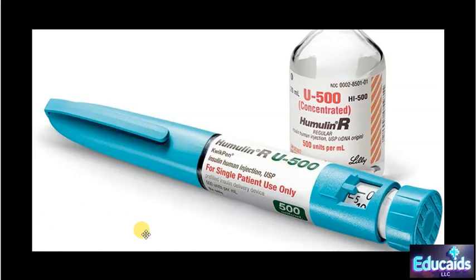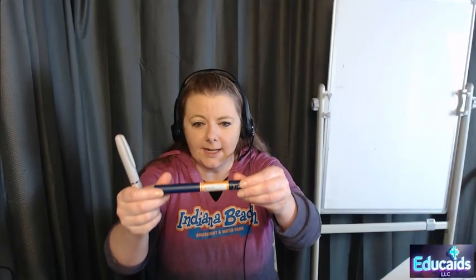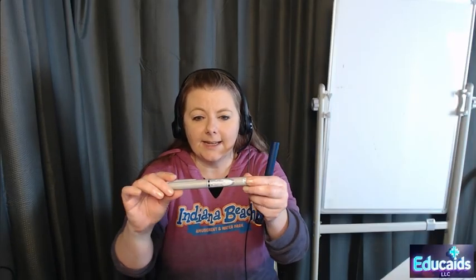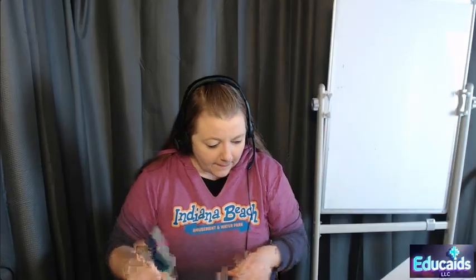All right, so now we are going to talk about how to give an insulin injection with a pen. Okay, so I've got two example pens here. I've got our Novolog, okay, so it's going to hit us like a log, and our once a day Lantus. All right. Now, sometimes this can be really hard to read out of a book and see how to do it, but if you see a video, sometimes things make more sense.